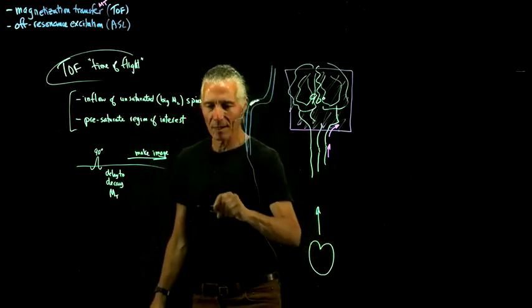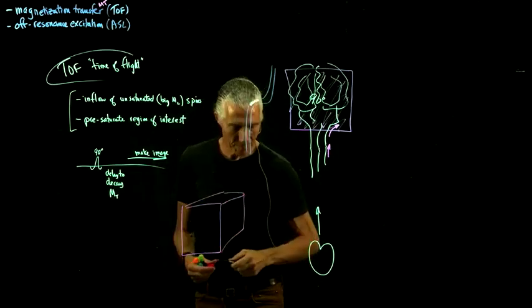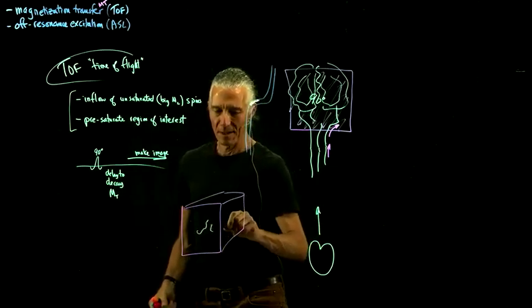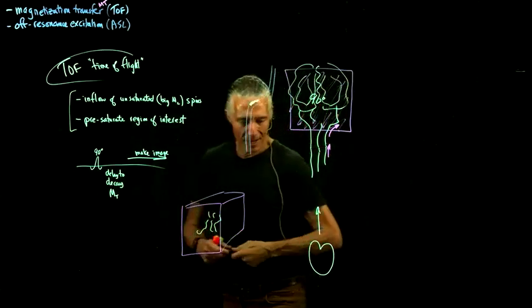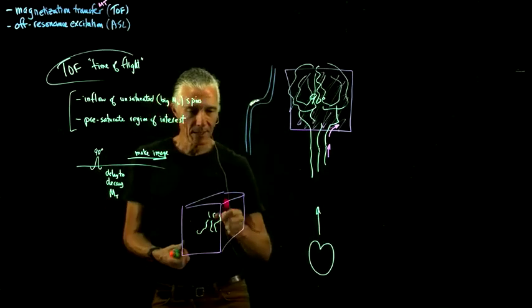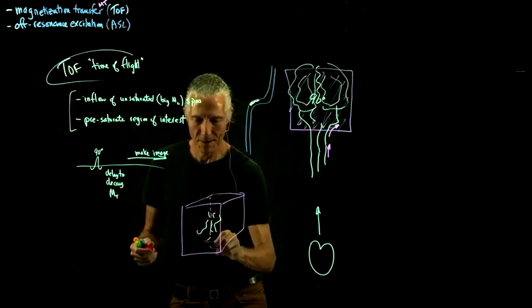But all you got to do is you just have a block. So you just recorded a block of data with some blood vessels in it. So there's some blood vessels in there like that. And then you just take that block of data and basically just make lines through it in one direction. So there's the block.